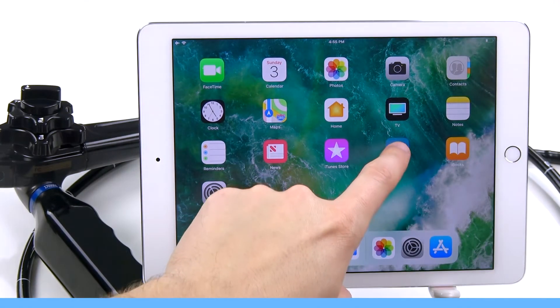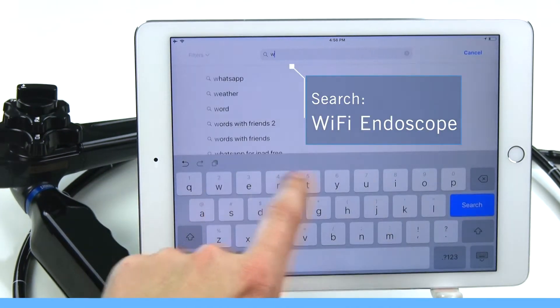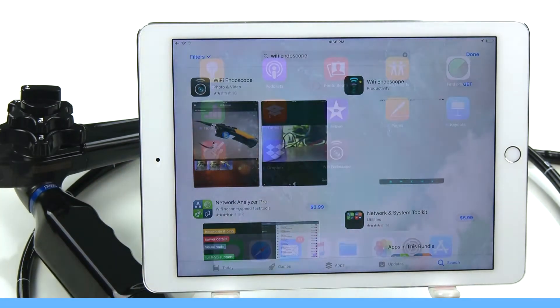Now that we're logged in, we'll go to the App Store and search Wi-Fi Endoscope. It's a free app, so let's go ahead and download it now.